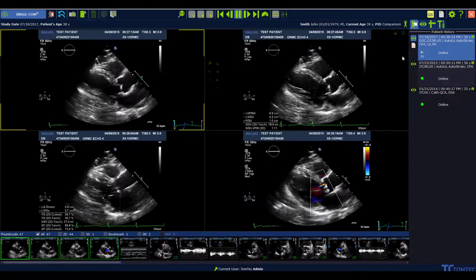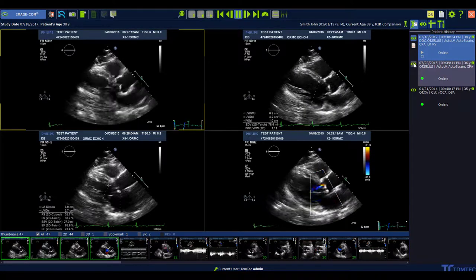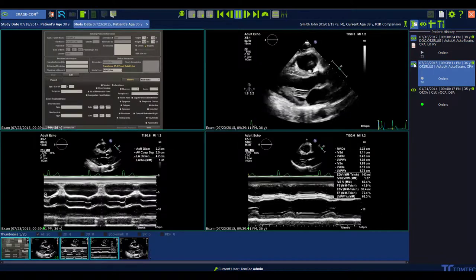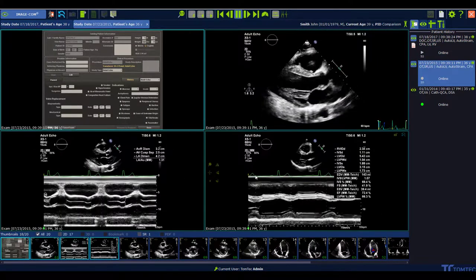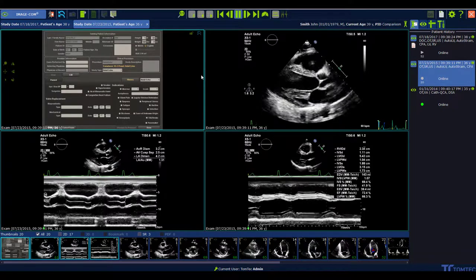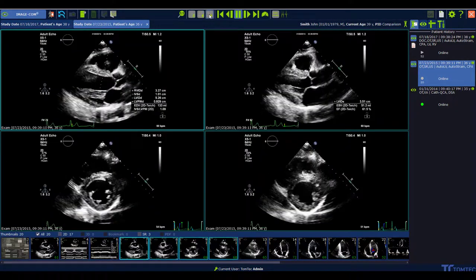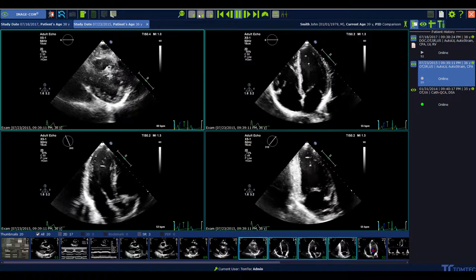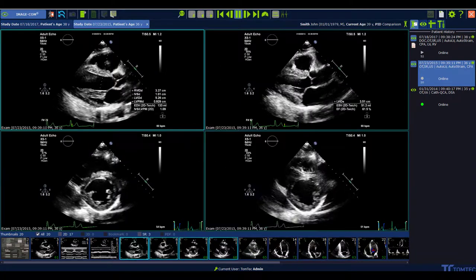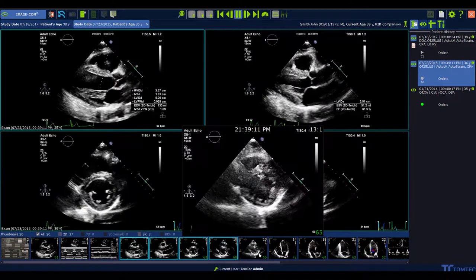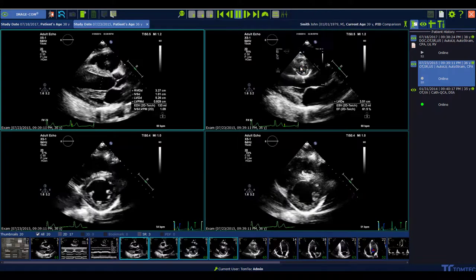If you want to see the old study also in the image viewer, then you can press the green eye, and now you see the old study marked by the blue frame. You can jump forward and backward in the old study, and you can also drag and drop images in the viewing area.